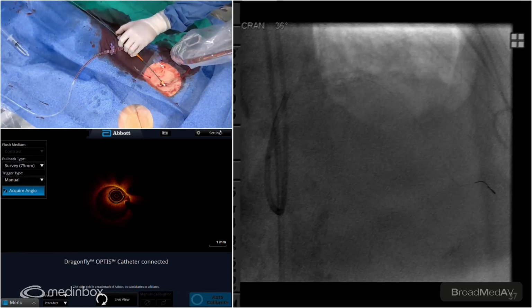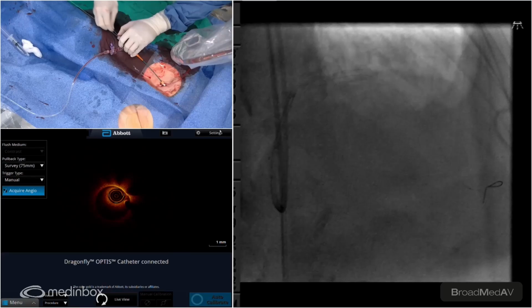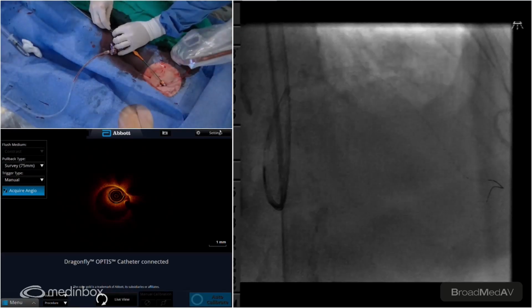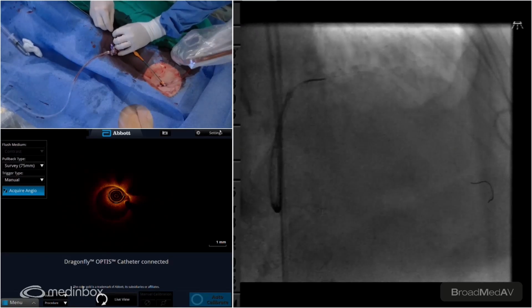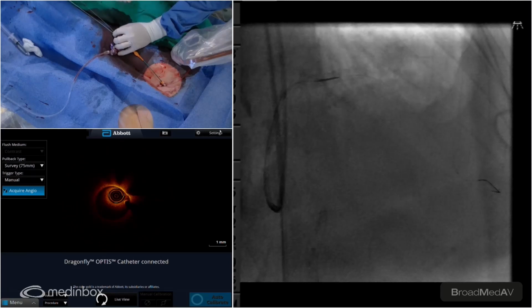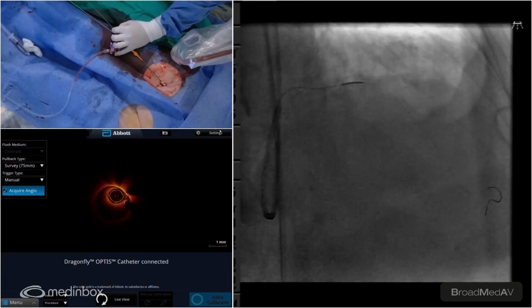Perfect. You can pin it there for me. Let's come down with a trapper. Trapper down. 12. And this is the spiral we have, right? Correct. Perfect. What I usually do is a little bit of a spinning motion, trapping the wire with my pinky. A couple of turns, see how it moves. And I think it's moving freely without much issue.